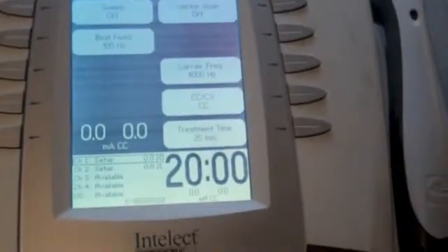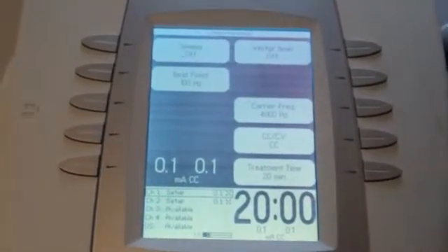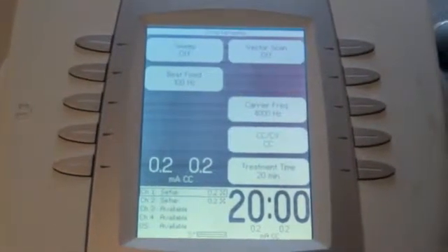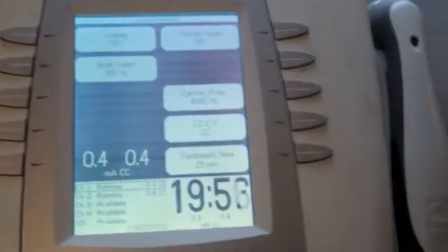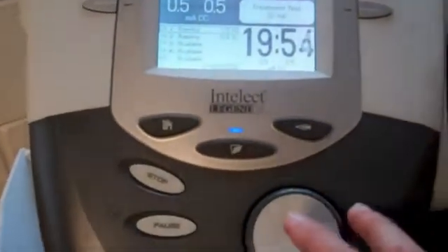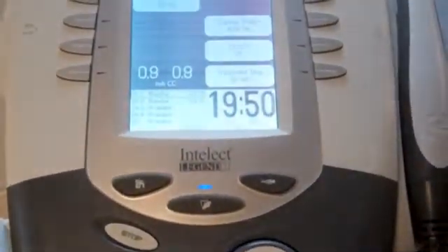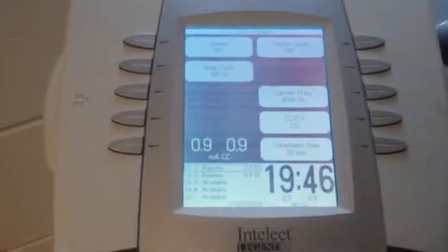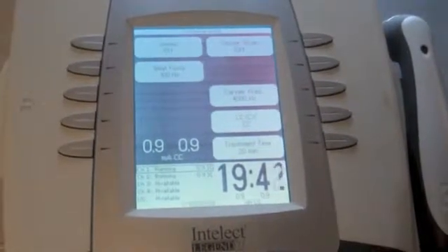So it looks like we're all ready as far as treatment, so we go ahead and start this by turning the intensity up, and then we can push start, and from there we can turn the wheel down here to increase the intensity until our patient says that's as strong as she wants to feel that, or we get a muscle twitch and we'll back it off a little bit from that.